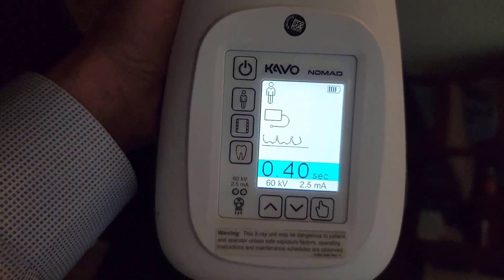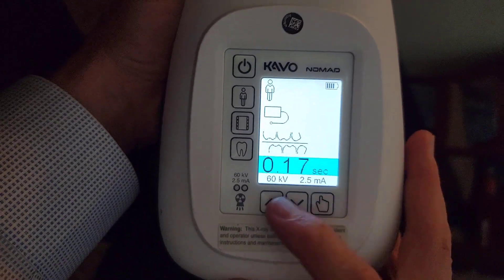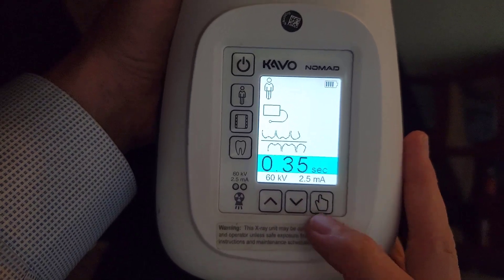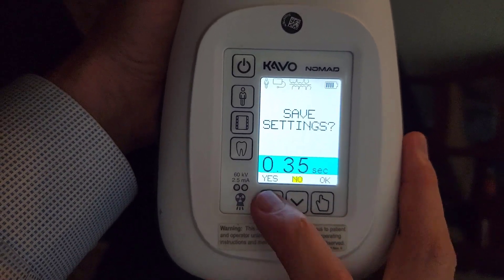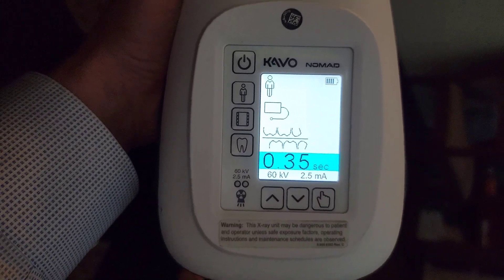Now we need to change the bitewing. That's all the way down to 0.17, but actually I want it doubled — I want it 0.35. Click the select once, click yes, okay. And that should be good.